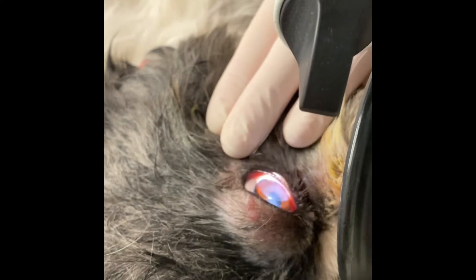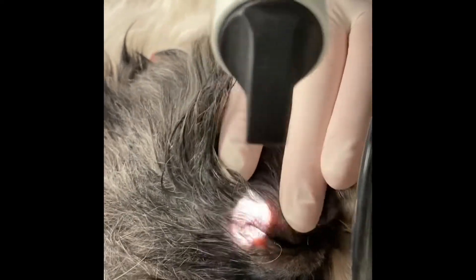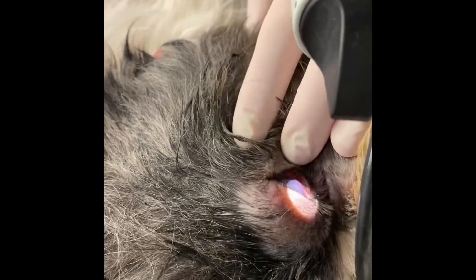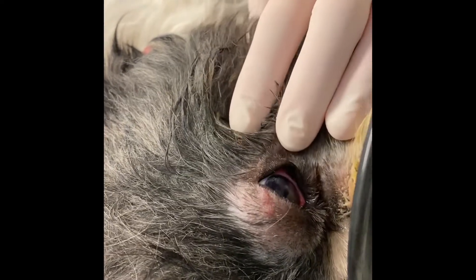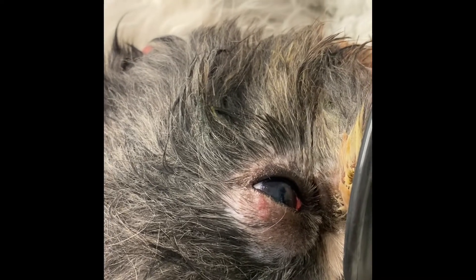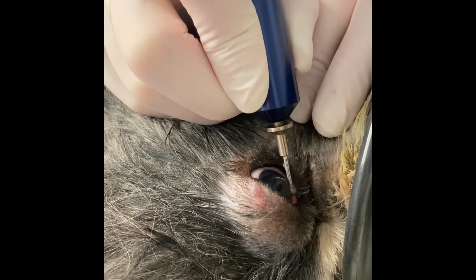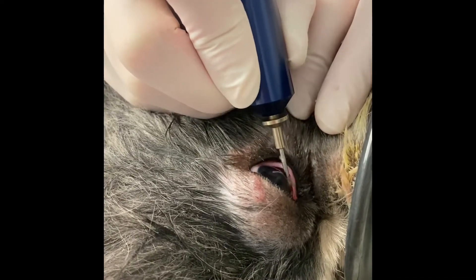Here in this video, I now show you that after performing the diamond burr, I re-examine with the slit lamp to see the extent of where I've performed that procedure, and if necessary, just go over a little bit of a wider area with my diamond burr.